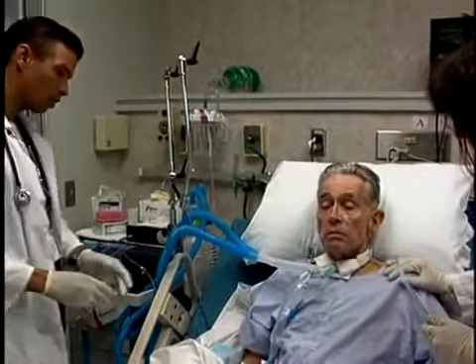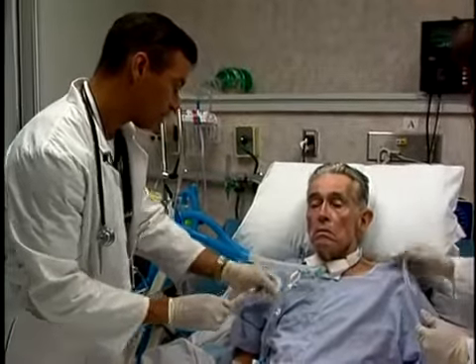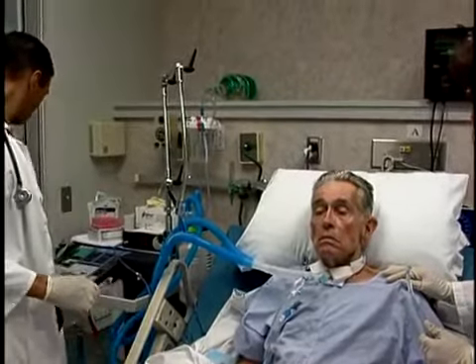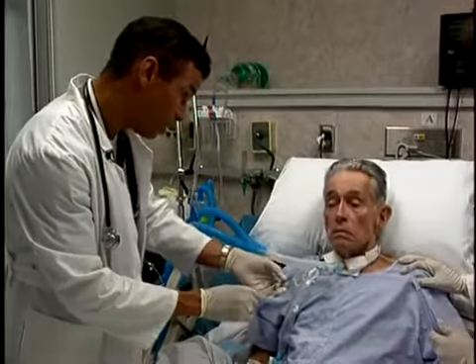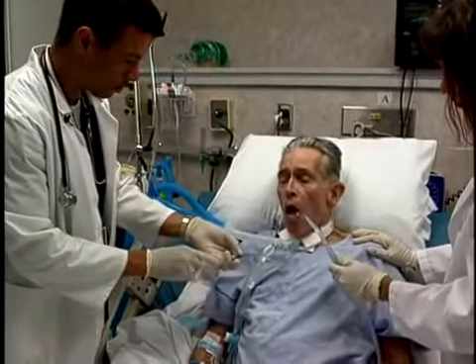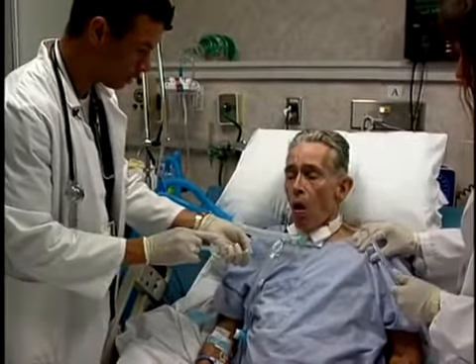This technique is especially appropriate for those patients who have been ventilator dependent with their cuff inflated for long periods of time. Once the cuff has been deflated utilizing this gradual method, if the valve is used on a regular basis, the patient will have acclimated and be able to tolerate normal cuff deflation. During cuff deflation, the patient may experience coughing due to mobilization of secretions. Allow the patient time to move and expectorate these secretions.